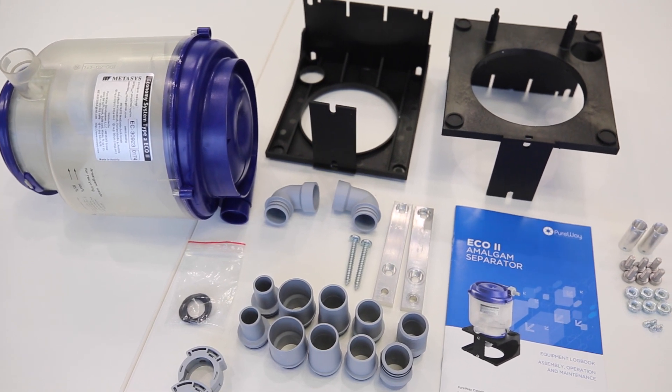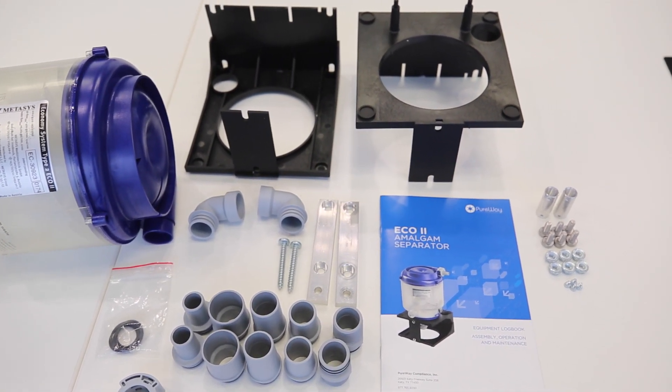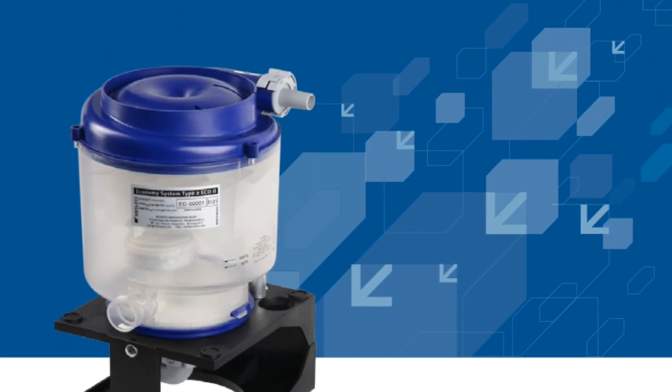The Eco2 requires minor assembly before being ready to install. Just follow the step-by-step instructions provided in the installation manual.